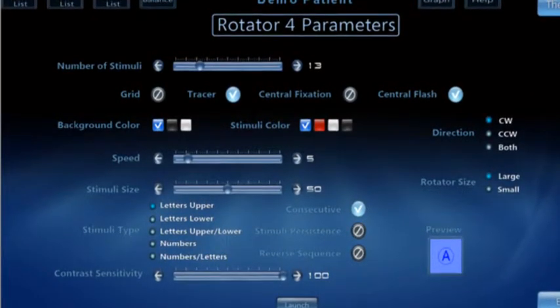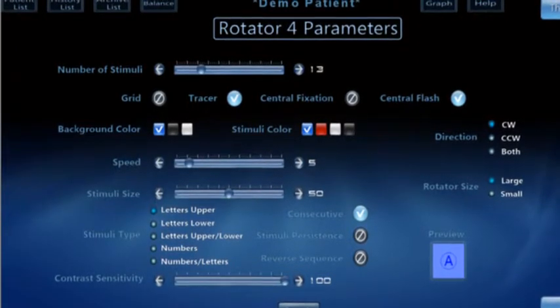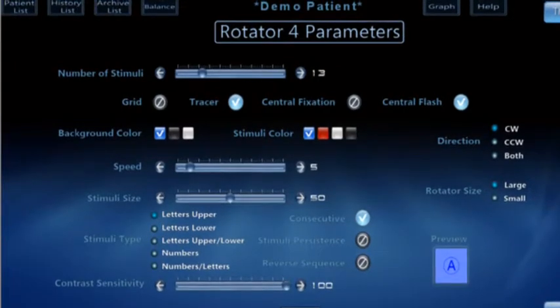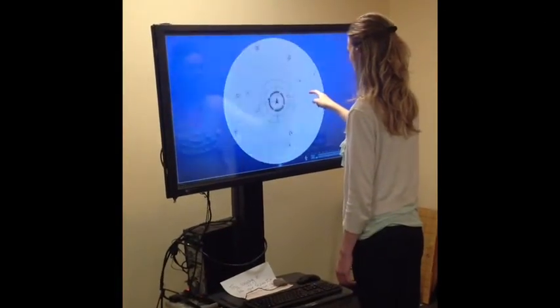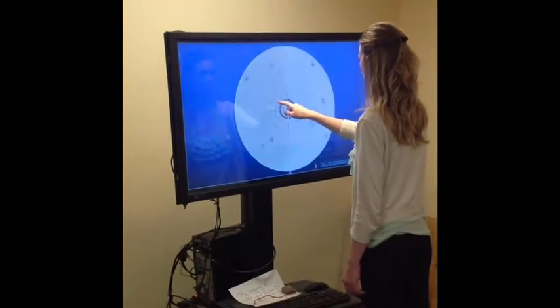Here are the parameters for Rotator 4. You can choose to have the letters or numbers appear consecutively or have breaks between the letters and numbers. In Rotator 4, the sequence doesn't start at the beginning — for example, it doesn't start with A or 1.